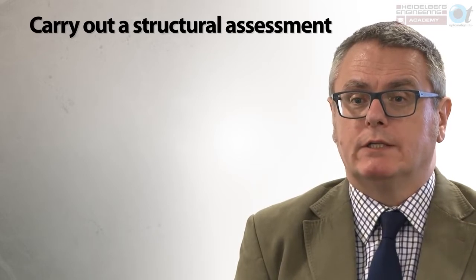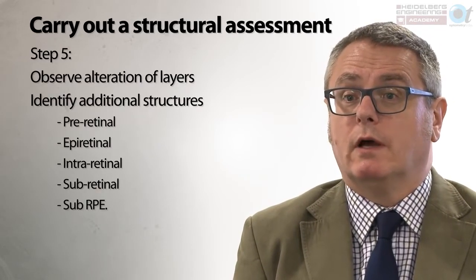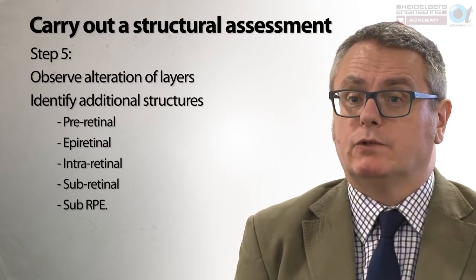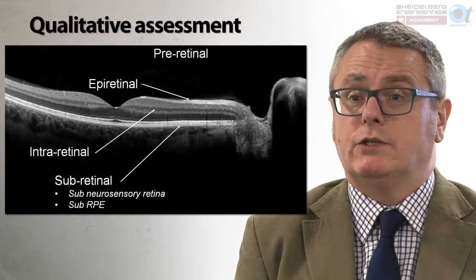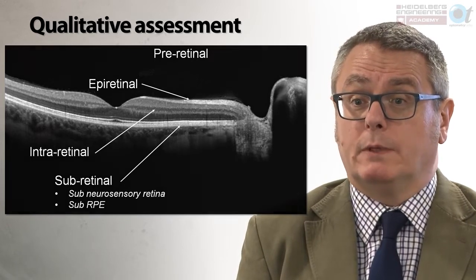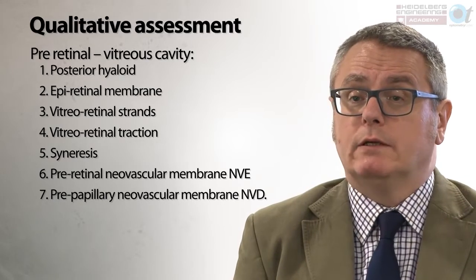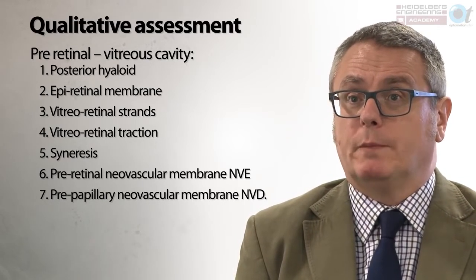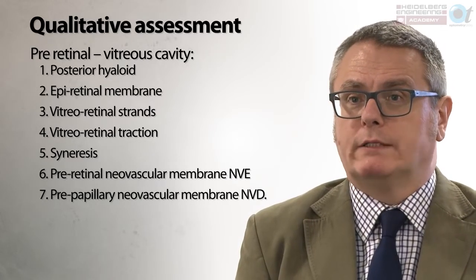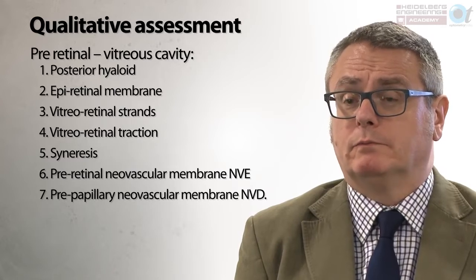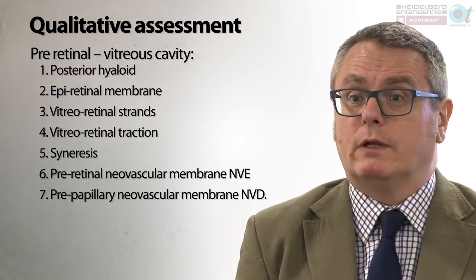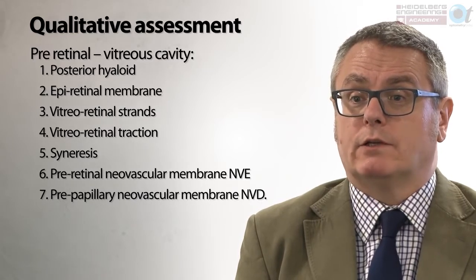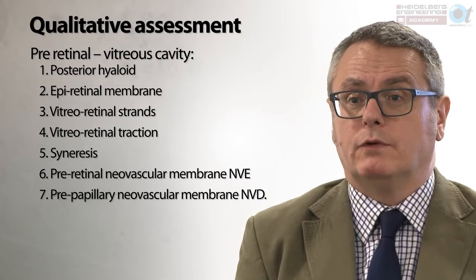Then carry out a structured assessment of the scans, observing alteration to normal retinal structure and identifying additional structures in a pre-retinal, epiretinal, intraretinal, and subretinal location — looking for changes within the vitreous cavity, on the surface of the retina, within the neurosensory retina, underneath the neurosensory retina, or underneath the RPE. The vitreous cavity should be minimally reflective; vitreous is approximately 98% water and 2% collagen, so any reflectivity should be viewed as abnormal. The most likely structure seen is the posterior hyaloid associated with posterior vitreous detachment, but epiretinal membranes, vitreoretinal strands, traction, syneresis, and neovascularization may also be visible. Changes in density such as the premacular bursa or space of Martegiani can also be detected.